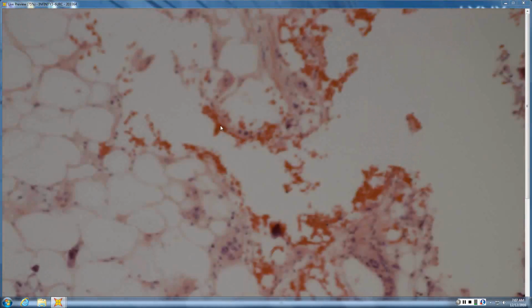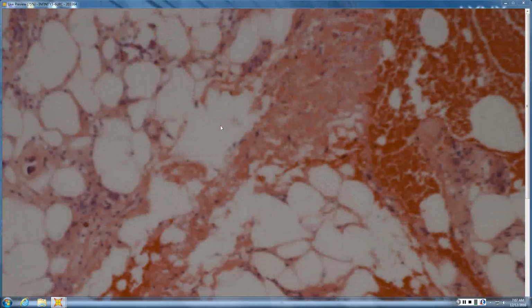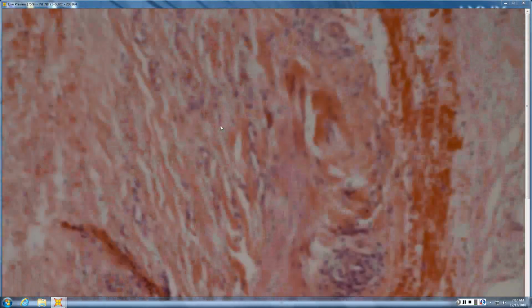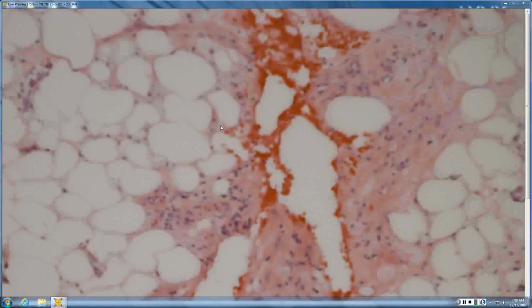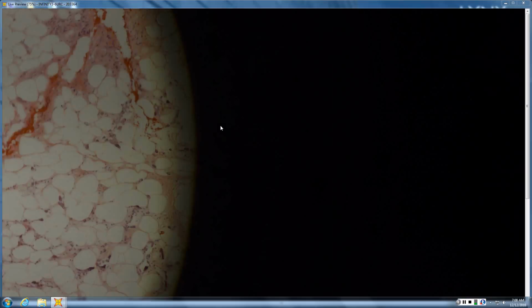I'm not sure I saw any in here, though, when I was looking before. What else in the vessels would be nice to see? Or typical to see? Is it thrombus? Yeah, so thrombi. They usually go right along with it. So I didn't see any clear-cut thrombi here, but sometimes it's really nice when you see that. And you can get necrosis in the biopsy.